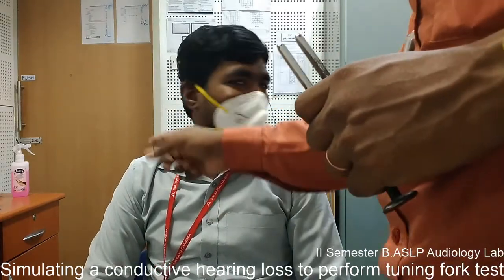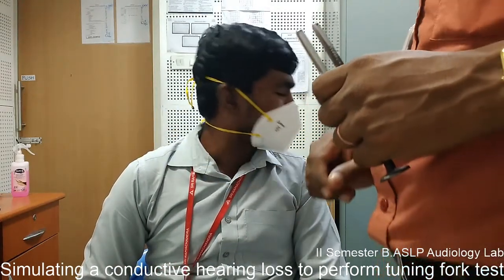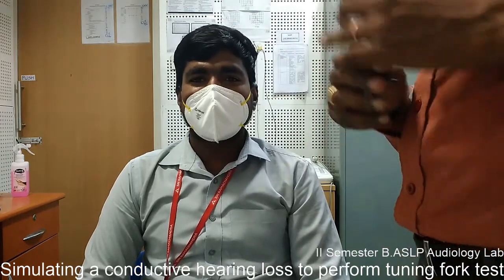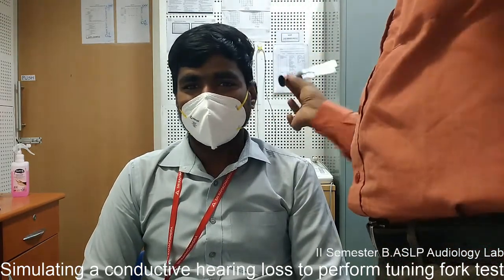The other ear, the right ear, is not occluded. So the left ear is occluded and the right ear is unoccluded. Let us now perform the tuning fork test procedure.